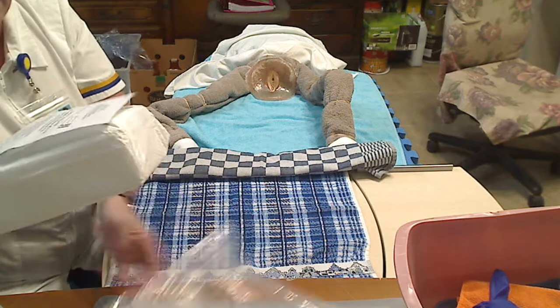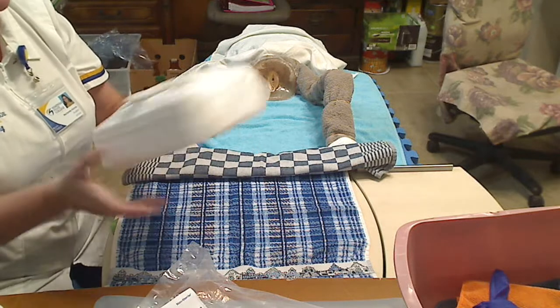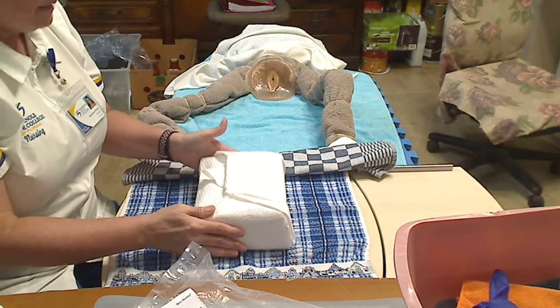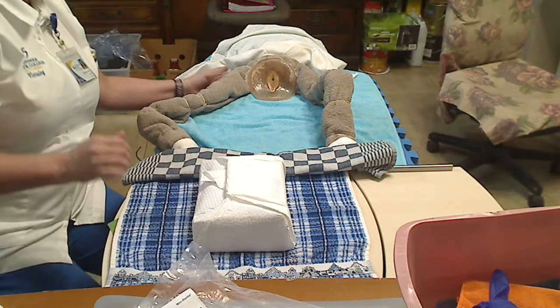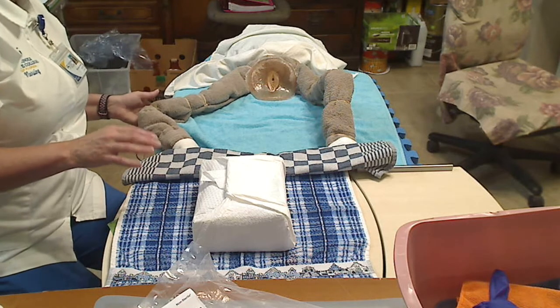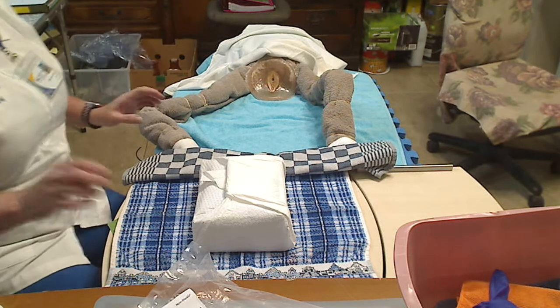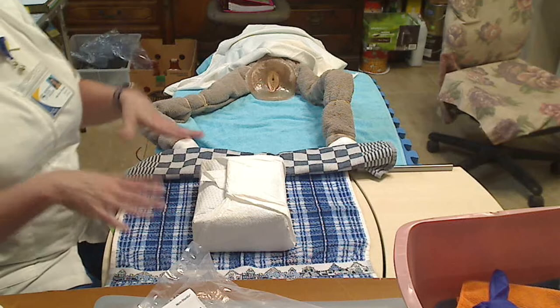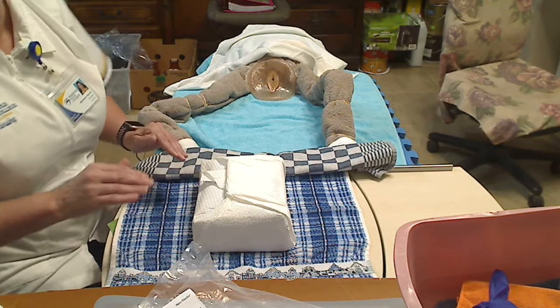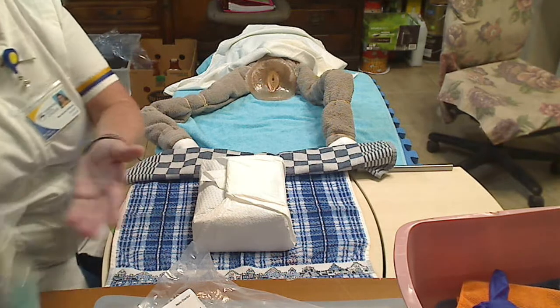I'm going to open up my packaging, and I'm going to place the tab away or towards me so that I can first fold away. I'm going to do this between her legs. Miss Anna, I need for you to stay as still as possible because I've got my kit in between your legs. If you're uncomfortable, please just let me know, okay? Okay. So from here, I'm going to go ahead and start using my sterile techniques to make sure that I don't contaminate anything. You can either use gloves or not. I'm choosing not to use gloves.